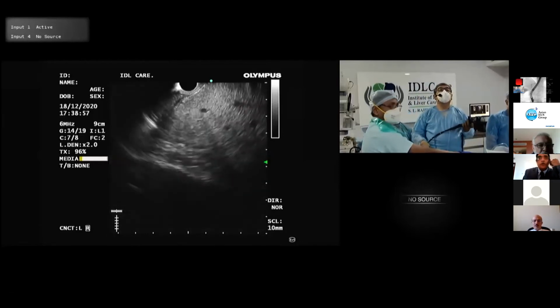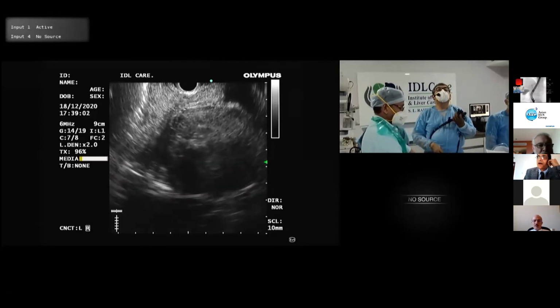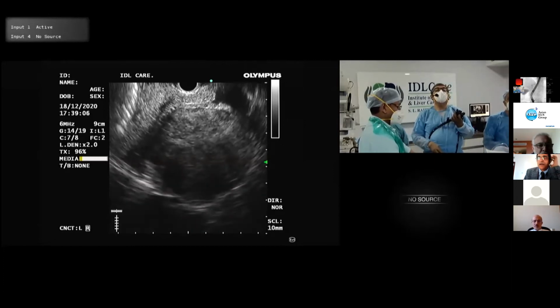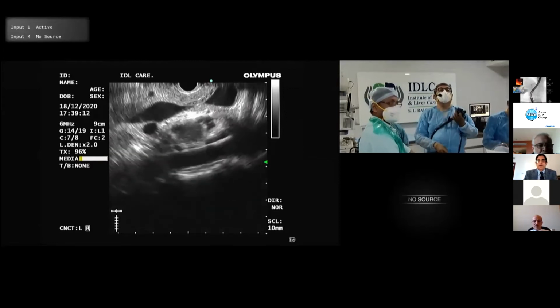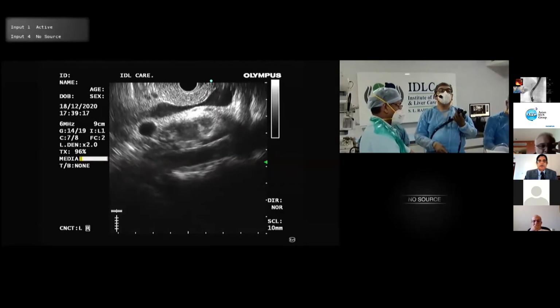What is the role of contrast enhanced EUS, patient? Practically very little, only in cases where you are not getting your biopsy in the first go. I would try to think of contrast, otherwise no.